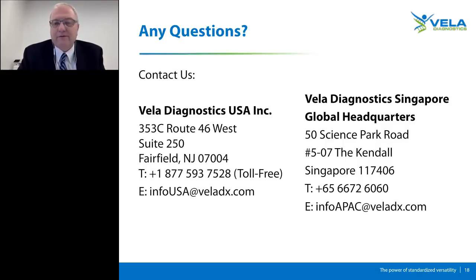Although the guidelines today may show higher mutant allele frequencies as being clinically relevant, we have also been working with collaborators who tell us that we should be driving those mutant allele frequencies as low as possible because they are seeing clinical relevance of those in many of their patients today.